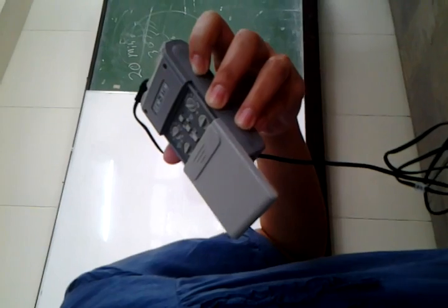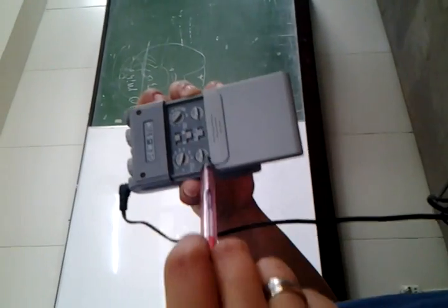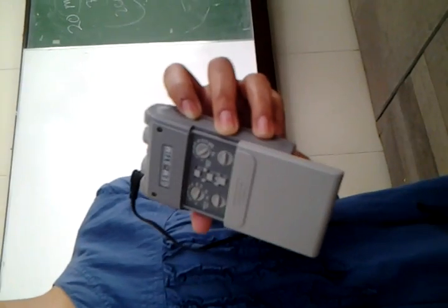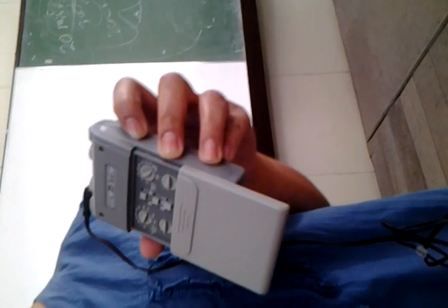Okay? And then, before we proceed to your EMS, let us try first on a patient. Since you already know the proper placement of your electrodes from your diadynamics, and diadynamics is more for pain reduction, basically the same principle. So can I have a volunteer PT and a volunteer patient? Patient. Oh, patient.